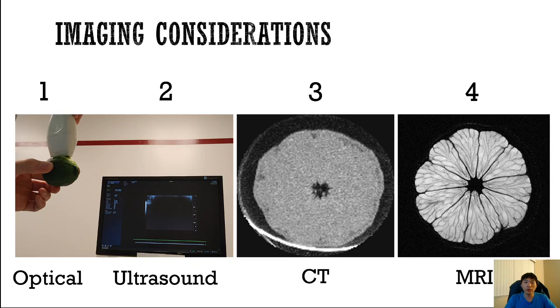So in terms of a clinical scan, going through the 4 different modalities, optical is basically instant, and it's the same with X-ray imaging. So plain film X-rays are basically instant. Ultrasound, again, is pretty instantaneous. So as soon as you put the transducer onto your object, you start seeing images or a video, I guess, of the object. CT, the normal kind of clinical exam, CT takes about 5 to 10 minutes.